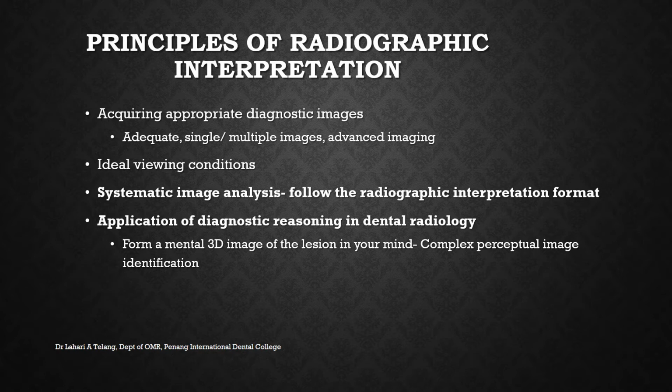Also, are single images enough for the case, or do you require multiple images? When you're doing a plain radiograph, let's say you want to see one area and you're not satisfied with the appearance of the tooth. Let's say it's a root canal treated tooth and you're trying to assess if the root canal treatment has been done well. So you might want to take another image with the shift technique to assess all the canals, whether they've been filled or not. And when do you apply advanced imaging?